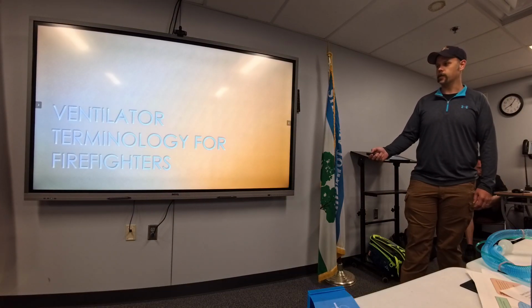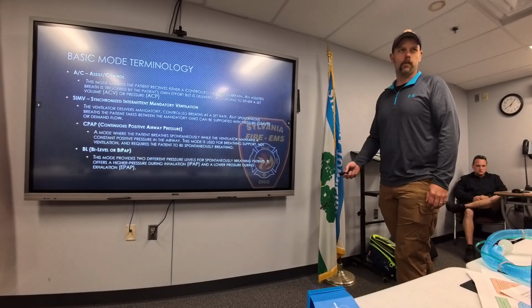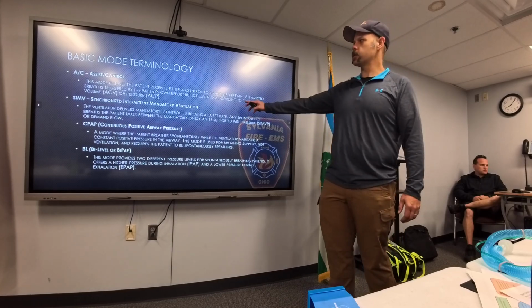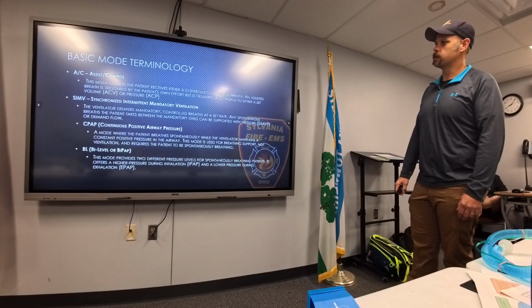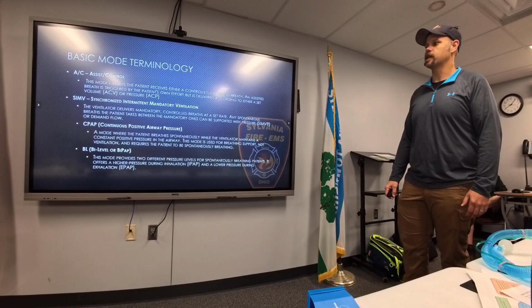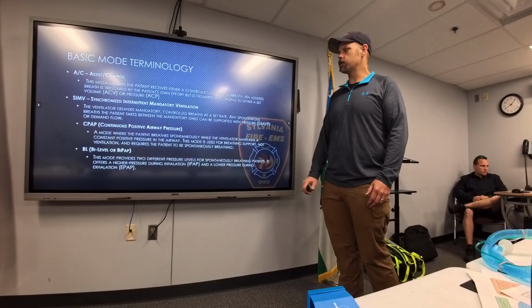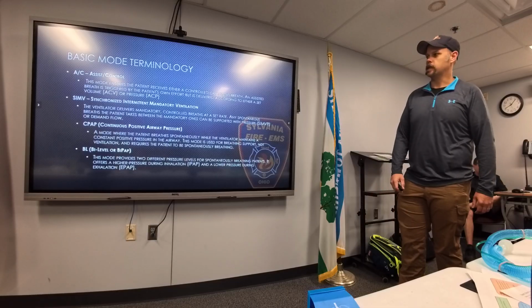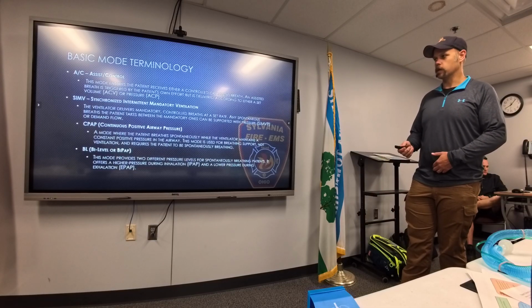Vent terminology for firefighters. So these are some different basic modes of ventilation. This is invasive ventilation if we have somebody that's intubated. Assist control: this mode ensures the patient receives a controlled or assisted breath. The breath is triggered by the patient's own effort, but is delivered according to either a set volume or pressure. Synchronized intermittent mandatory ventilation, SIMV, delivers mandatory controlled breaths at a set rate. Any spontaneous breath the patient takes between the mandatory ones can be supported with pressure or demand flow.